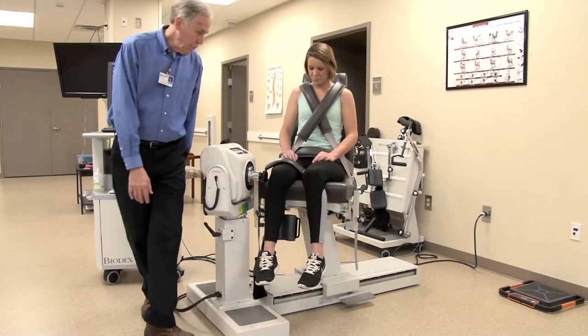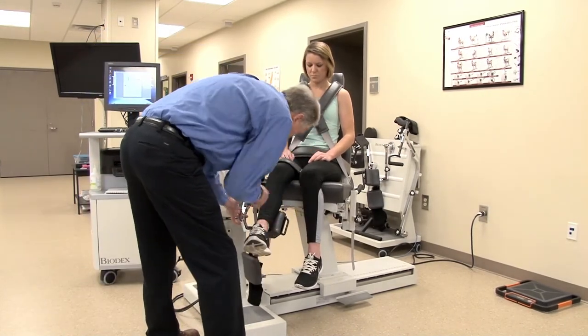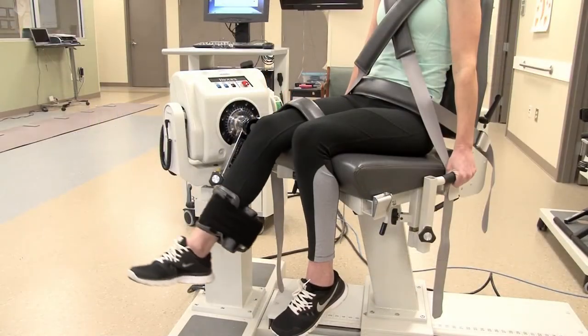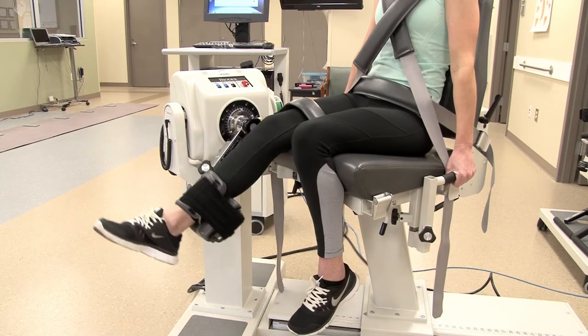After that they're placed in the chair. They have some straps on so that we can isolate the movement within the specific joint that is being evaluated. They will be given some practice reps, and once they are comfortable with the machine and the setup, we will actually start the evaluation itself.